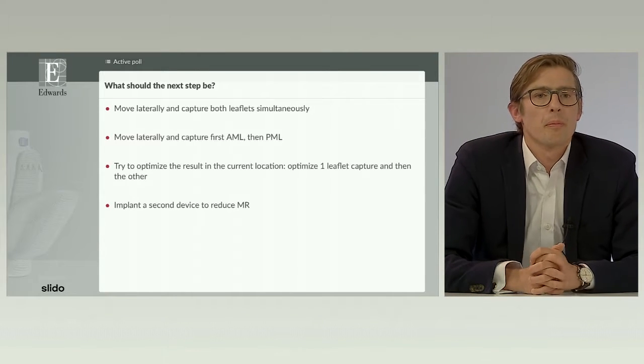So Philippe, thank you very much for your presentation. You've given a very clear description of the technicalities of the first parts of the procedure. Dr. Rui Tellez wanted to ask some specific questions. The first was in relation to the site of the atrial septal puncture. I think you did describe that, but can you reiterate that specifically? Where do you aim for?